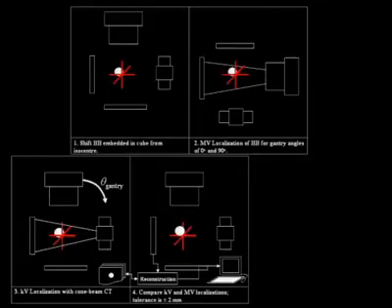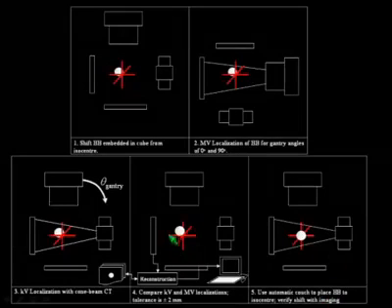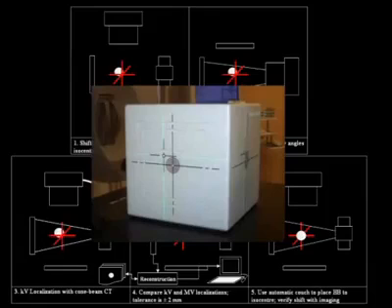And then we test the accuracy of the remote controlled couch by correcting, using the remote controlled couch, the position of the ball bearing, and we take another cone beam to verify the accuracy of the correction. And this can be done using an alternate set of markings, so therapists only align the cube according to these alternate markers.